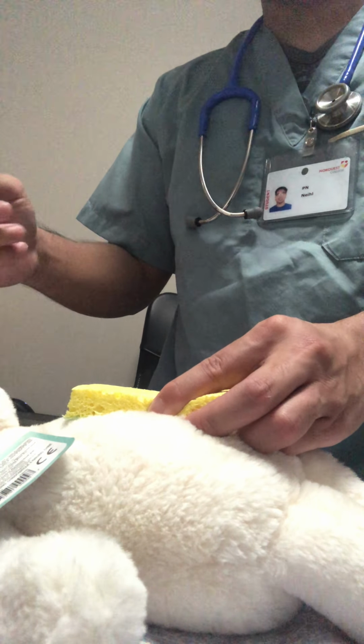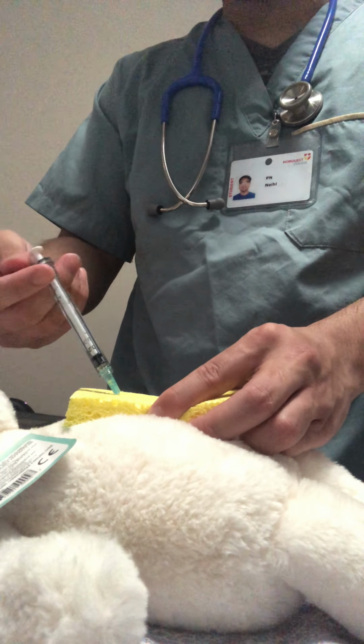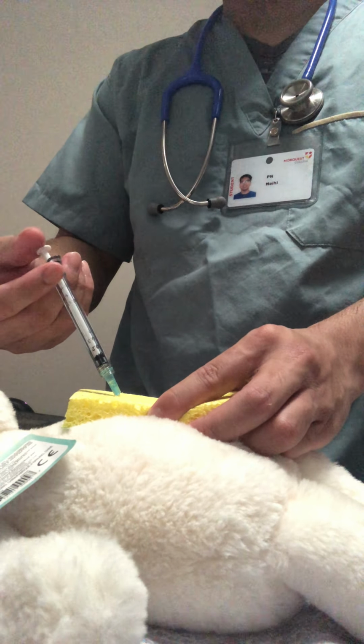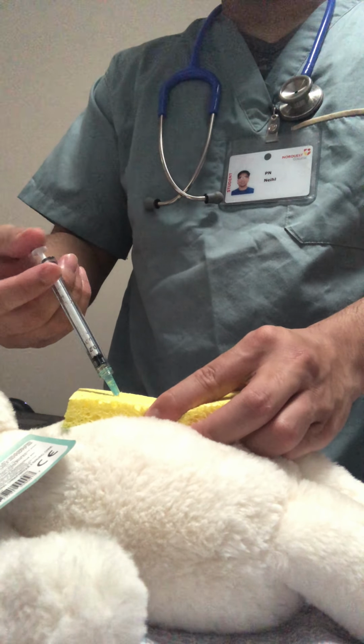Take this off, and I'm holding it for, oh sorry, I forgot, I'm holding this for 10 to 15 seconds. 1, 2, 3, 4, 5, 6, 7, 8, 9, 10, and then take it off.